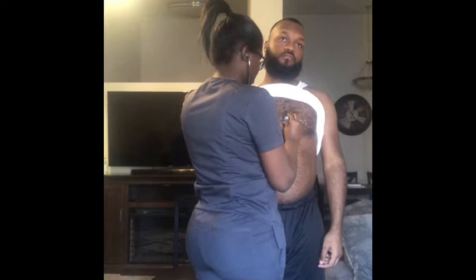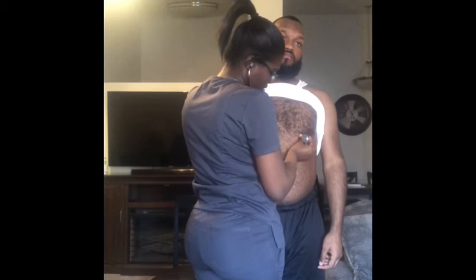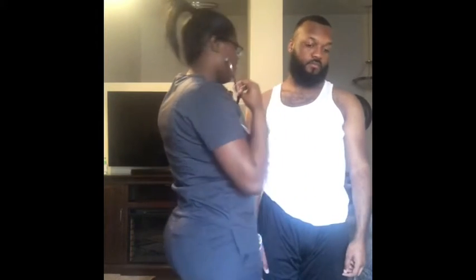And the Erb's point. We're going to go to the tricuspid. And now we're going to go to the mitral. Okay, so there weren't any abnormal heart sounds, such as any S1 and S2 deviations.